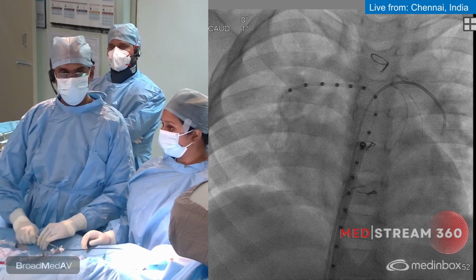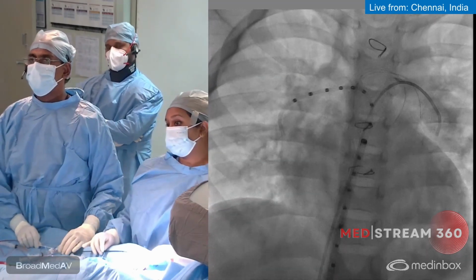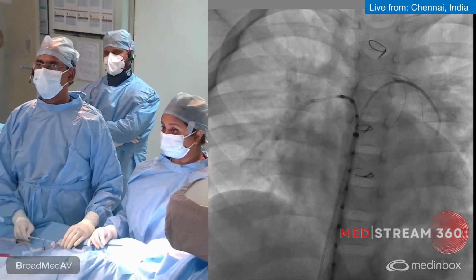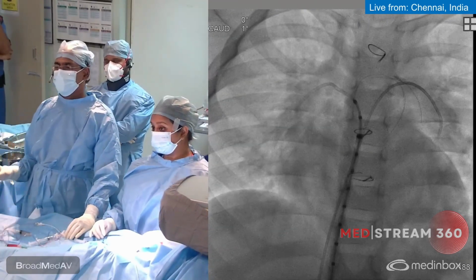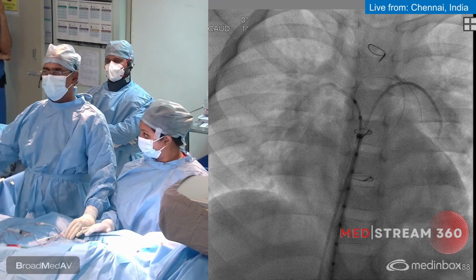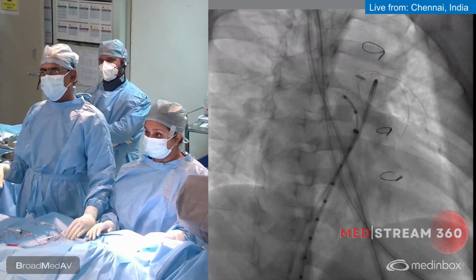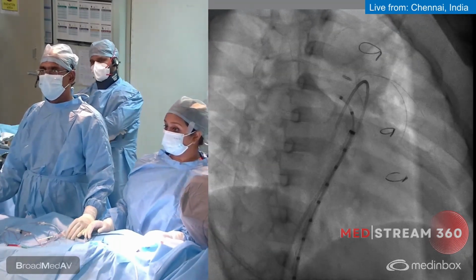What is the view you are choosing for angiograms in this case, sir? In a patient with LeCompte like this, what is the better view? Yeah. So the pulmonary artery here will be coursing from anterior to posterior, as well as from the midline towards the right. So we'll give a right anterior oblique for the right pulmonary artery and left anterior oblique for the left pulmonary artery. The marker is there to guide us a little bit more.